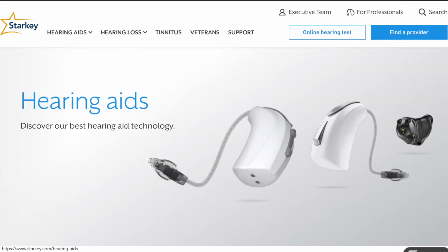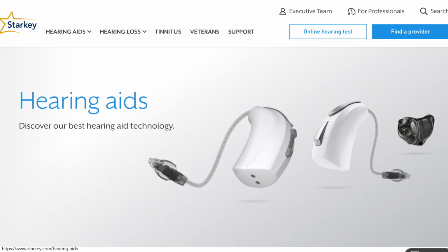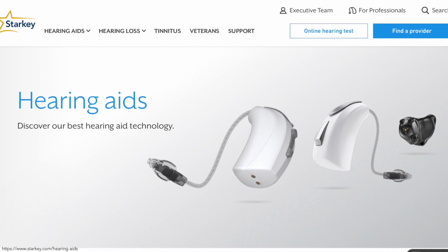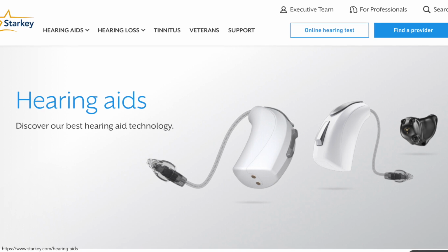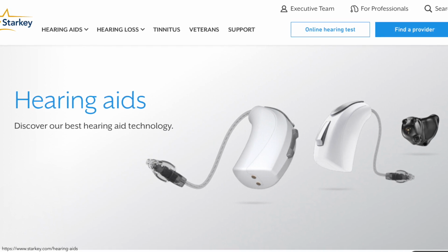A second type of hearing device technology is a hearing aid. A hearing aid uses air-conducted sound. It does not use bone conduction, nor does it include possible surgery like a bone-anchored hearing aid. Hearing aids fit either inside the ear or behind the ear. A hearing aid also uses microphones to pick up the sounds in your environment. The computer chip inside the hearing aid processes the sound so that the background noise is reduced and the speech sounds are amplified. This improves your speech audibility and clarity for improved communication.